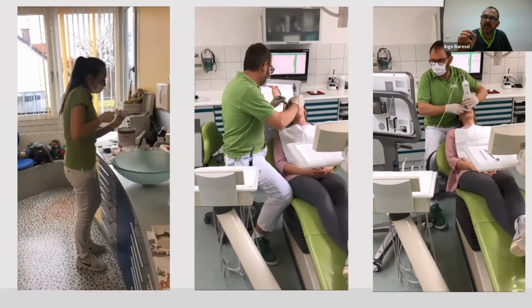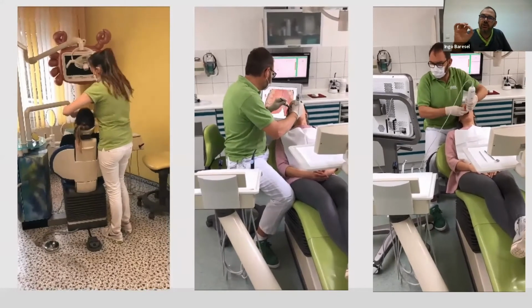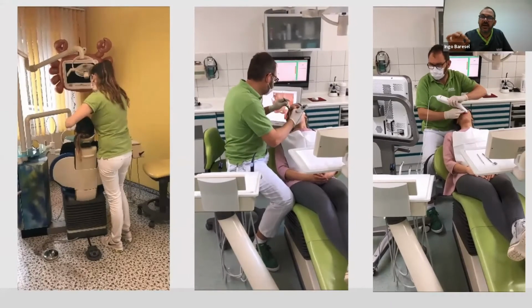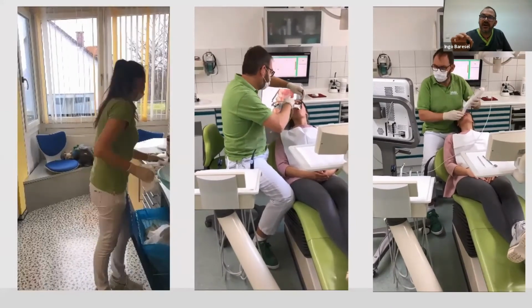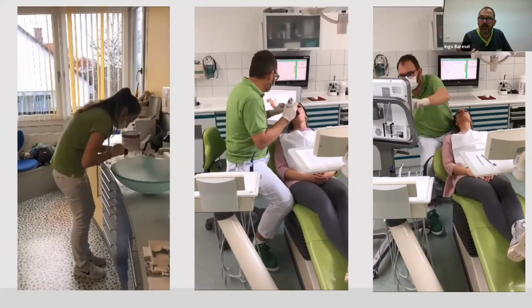So what is important? Look at me scanning at the right side. I'm just looking to the monitor. I'm not looking to the patient's mouth. And if you are able to do this, you can scan very, very fast and accurate. But if you are not able to do this, you have to train more.